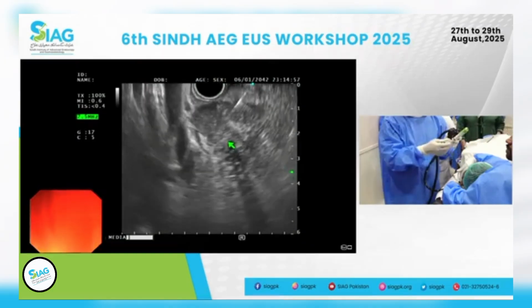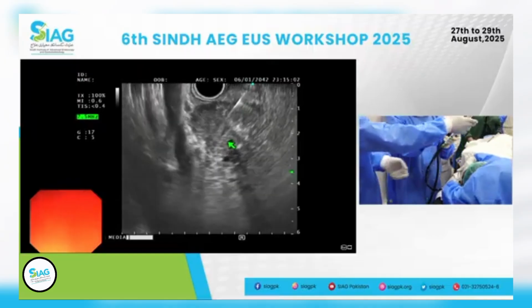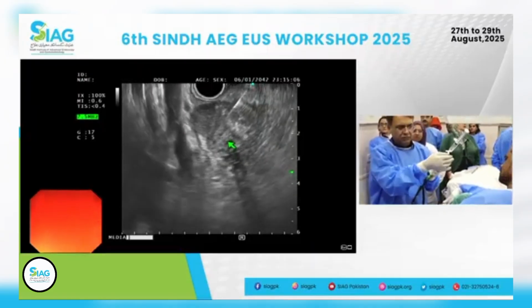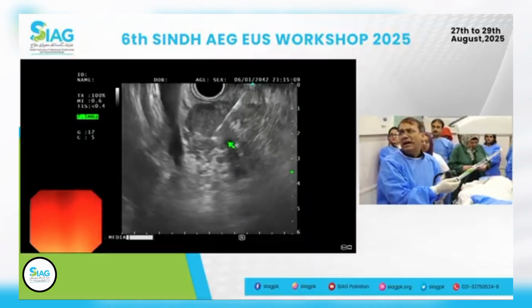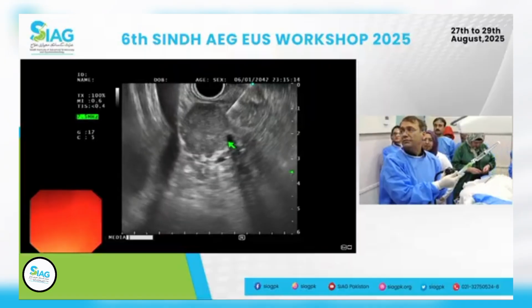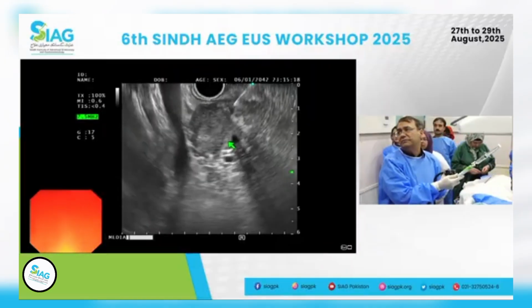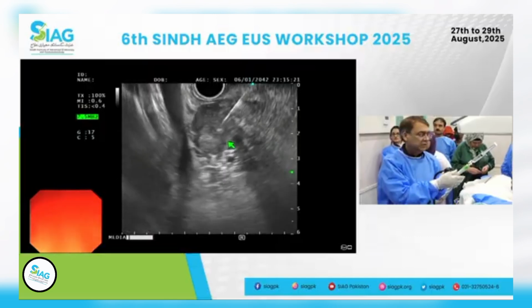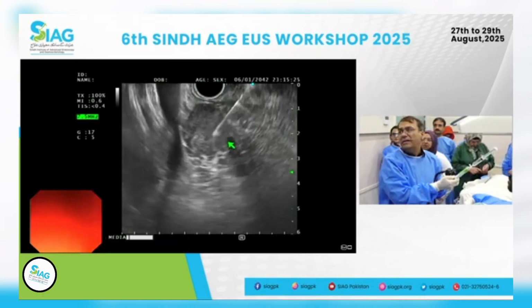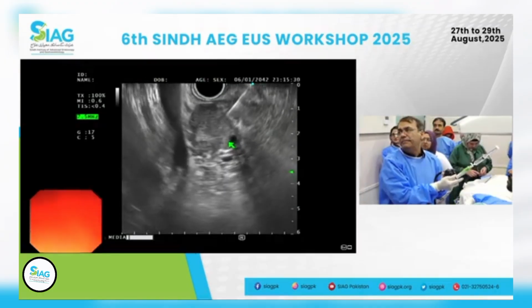Again, sometimes, Khalid, you have to come out of the tumor to actually change the direction. Sometimes, if you have to, then you can come out. But I think it's best, especially if you have suction on, that you don't come out of the growth. If you want to come out, then you have to lock your suction, go back in, and then open the suction. But when Khalid was doing the first one, he was obviously not using any suction, so there was no need to.